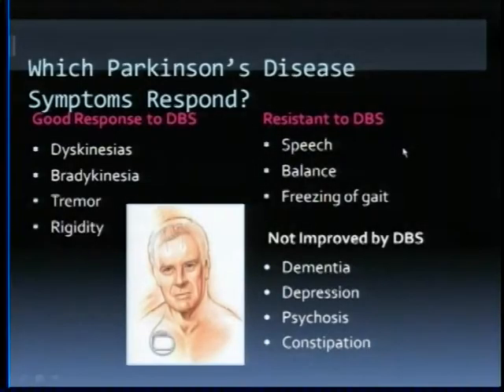This is a really important slide, and there's a couple extra pieces along with this that I'll go over today. I cannot stress this enough for patients looking at DBS surgery, and even after people have had DBS surgery. There are certain things that the surgery does a real good job for, and other things where it doesn't help as much. Now, I do disagree with some of these over here, and we'll talk about them a little bit further.